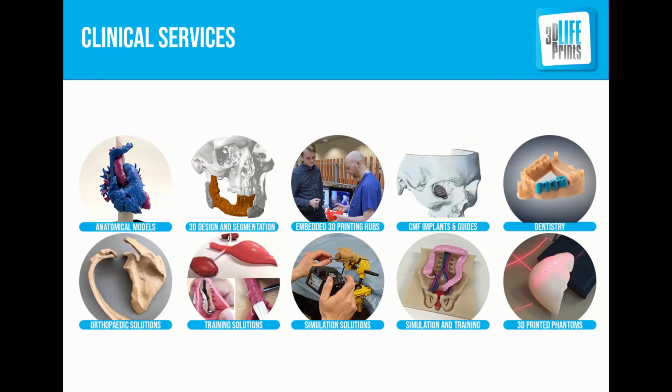So here in a snapshot, you can see a little bit more about 3D LifePrint's capabilities. We've spoken about the anatomical models, and those are the ones we'll mainly be discussing today, as those all begin their life as patient records and need to be run through Simpleware. 3D design and segmentation, you can see there an example of a surgical guide.